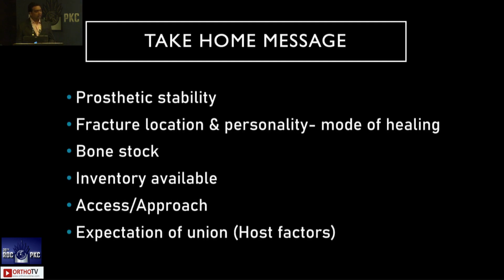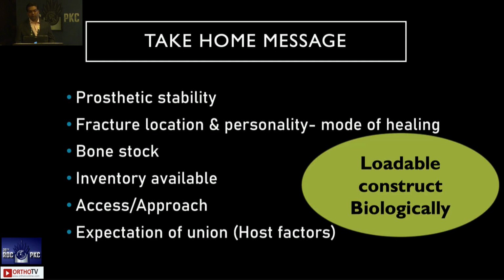So the take home message is that these are the points we need to take care of, the stability and the bone stock, and manage it on the principles of a biological fixation to create a loadable construct.